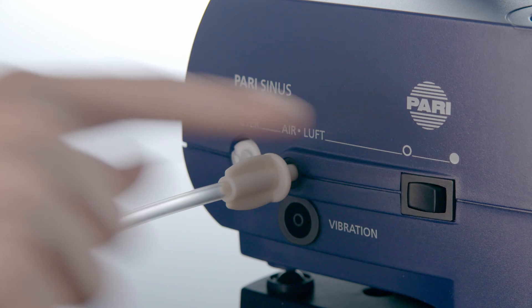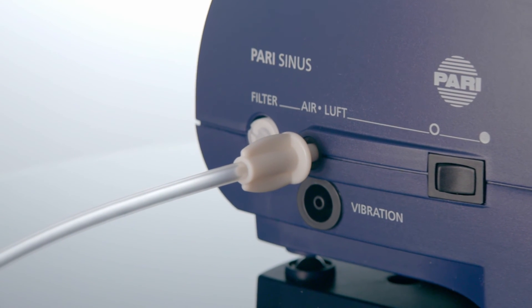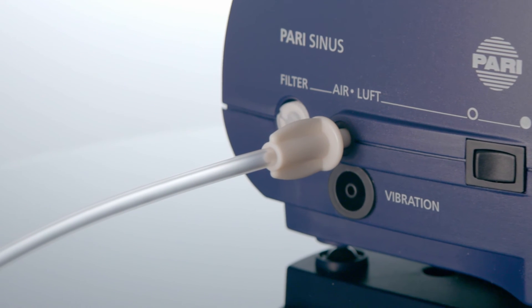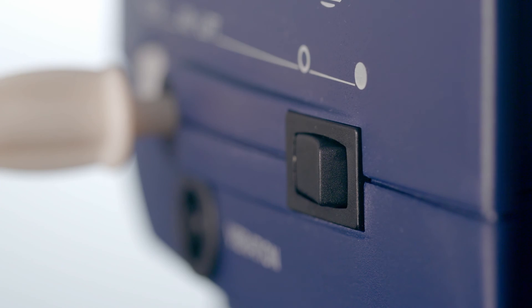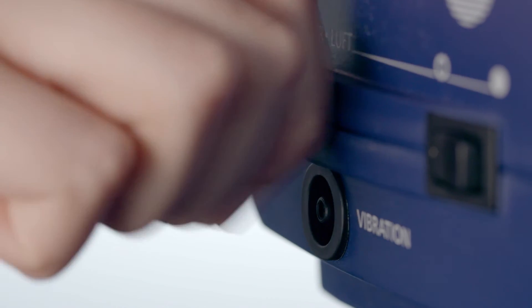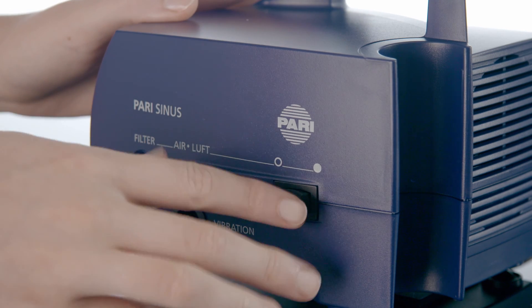To dry the tubes, insert the appropriate end of one tube into the air socket. Switch the device on and let it run until the tube is completely dry. Switch the device off. Now insert the appropriate end of the other tube into the air socket, and once again switch the device on and let it run until this tube is completely dry.